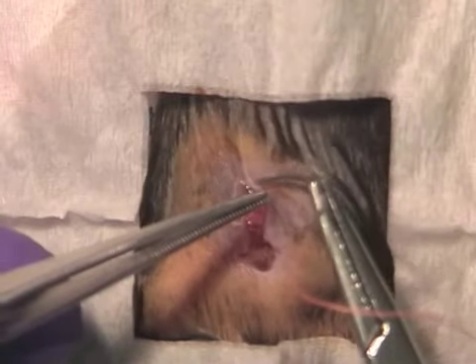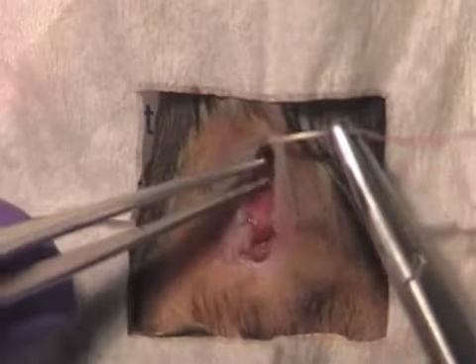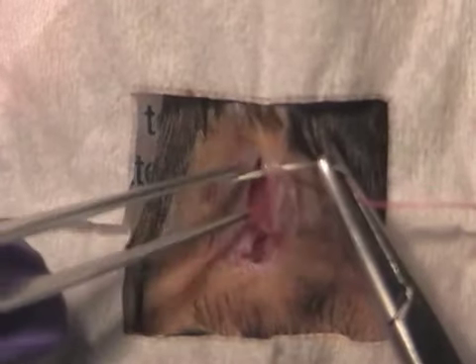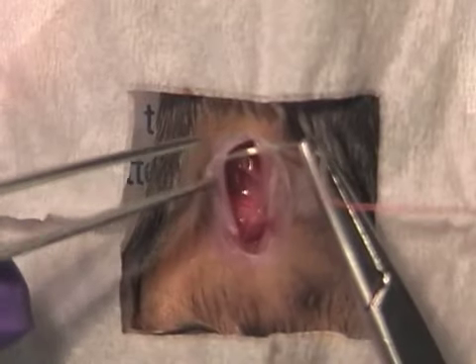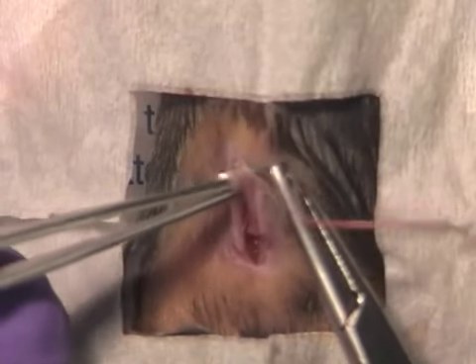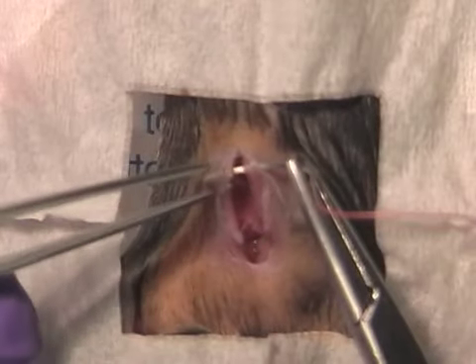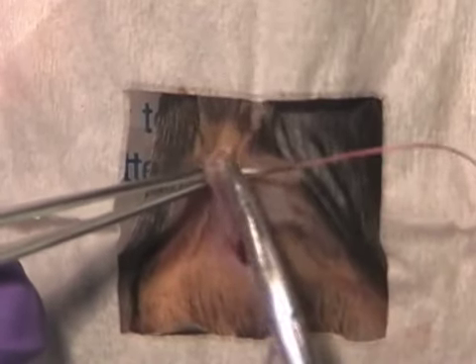The mouse abdominal wall is closed using 3 interrupted stitches using 3-0 or 4-0 size suture. Alternatively, one can use a simple running stitch. Postoperative analgesics and a fluid bolus may be given at this point.